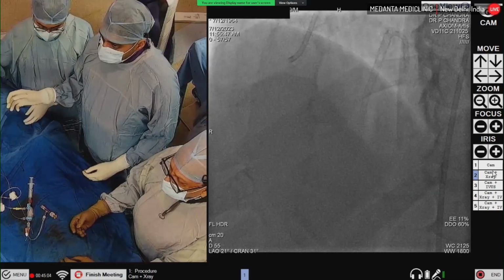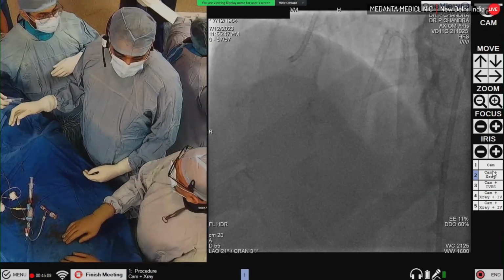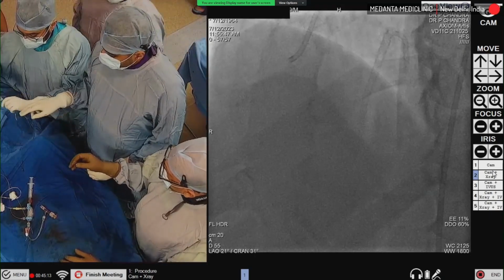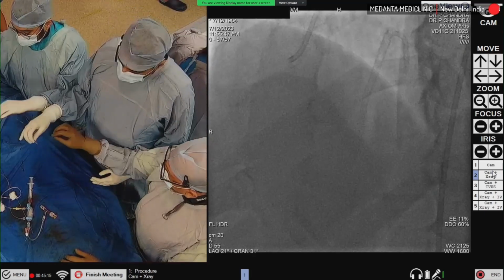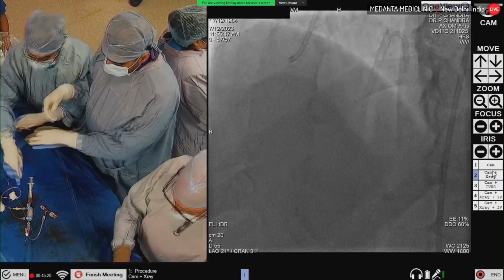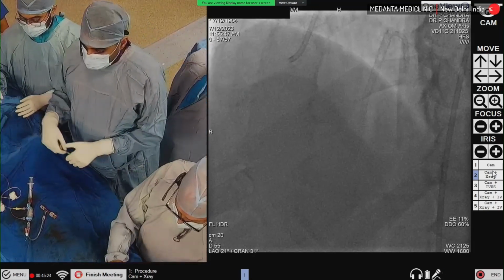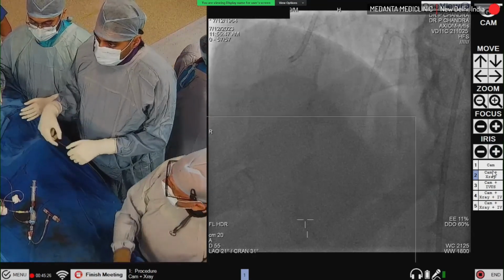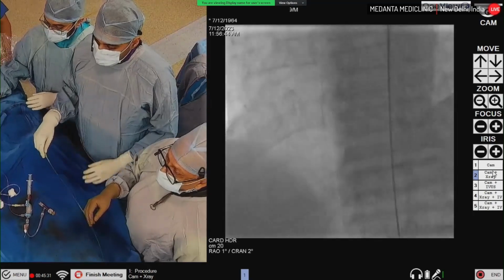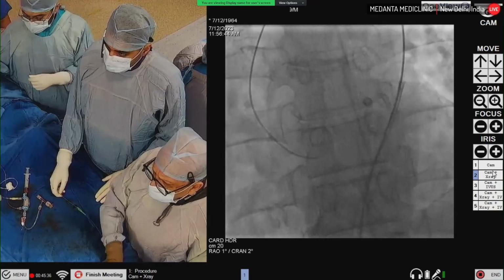And this was a bifurcation stent we did. So which year was angioplasty done for you? 2013. 2013. So this was 10 years back. Okay. We have discussed this in the history. Okay. 10 years back. Yeah. So the bifurcation stenting was done. Yes, bifurcation stent. So which technique? Is there any mention of that? Was it a DK crush or? I think most likely it was a DK crush. Yeah.